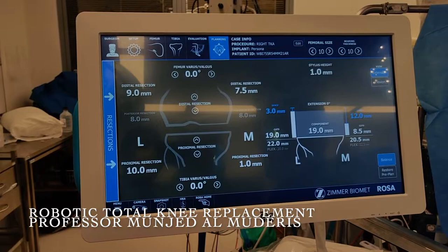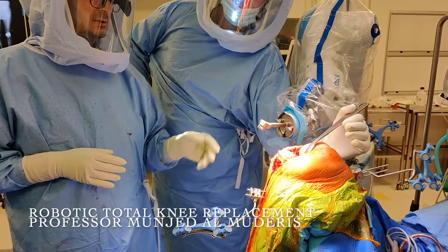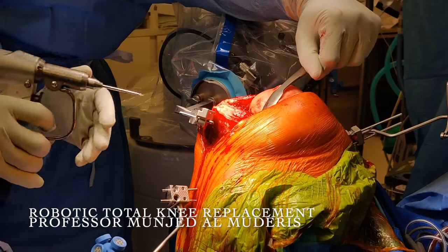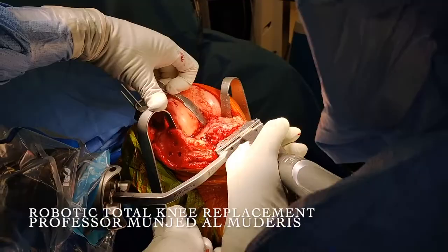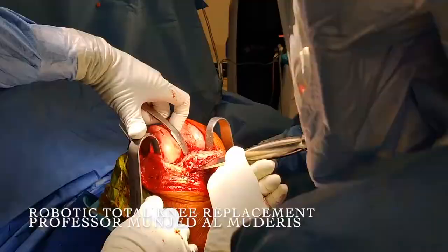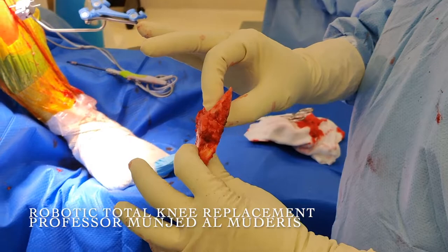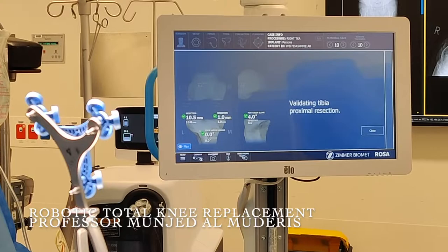We execute the plan and start the tibial cutting. We position the patient so the robot's arm can approach the tibia. The arm is seated appropriately at the planned cutting position, so we execute the resection. After the resection, I remove the robotic arm and complete the tibial osteotomy using an osteotome. The tibial resection is minimal on the medial side and approximately 10mm on the lateral side — exactly as planned — and we validate the resection, confirming it is very close to what was intended.